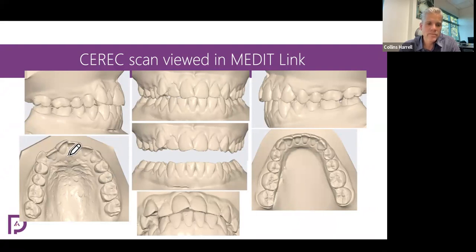And in the upper, a quick count of crowding is going from the mesial of the first molar to the mesial of the first molar and counting broken contacts. Okay, so the obvious broken contacts here would be 1, 2, 3, and then there's some minor ones. So I'd probably say there's 4 millimeters of crowding. You might even say 5 millimeters of crowding, but there's somewhere between 4 and 5 millimeters of crowding in the upper arch. So we have more crowding in the upper than the lower.